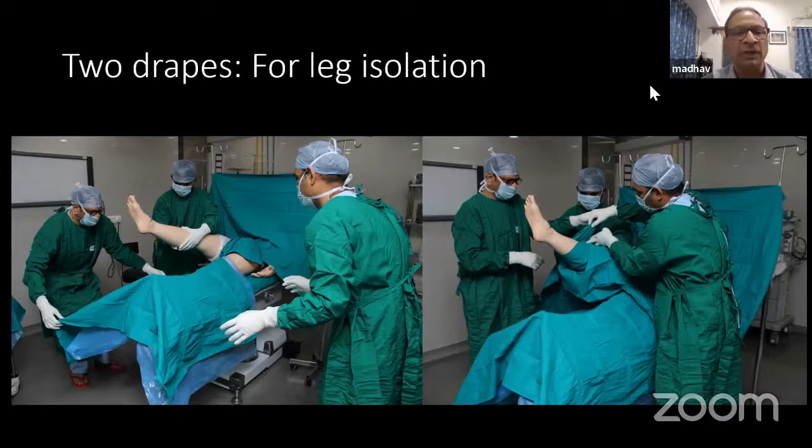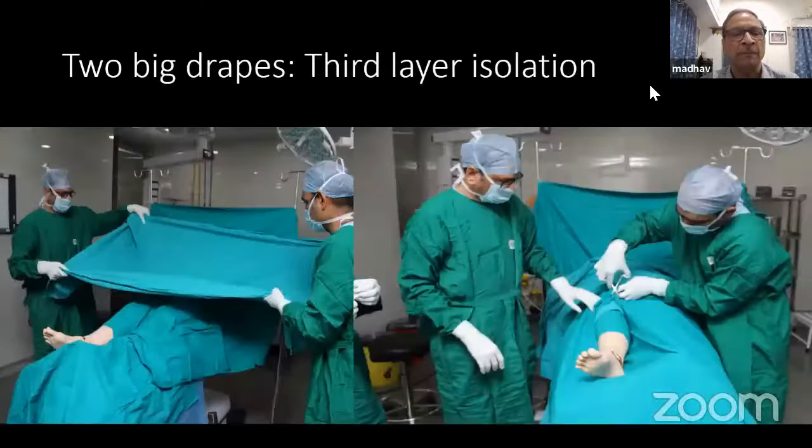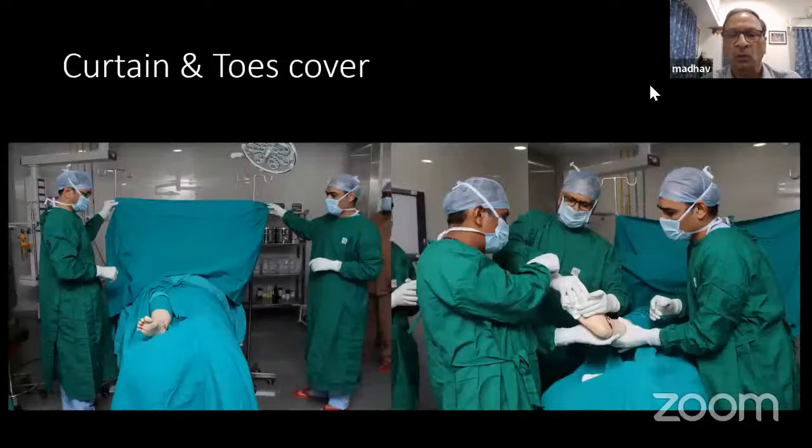The patient is in a supine position. The anesthetized patient is kept in the supine position. The limb is scrubbed and prepared properly by one of the assistants, and the assistant who has washed up and gloved holds the limb.